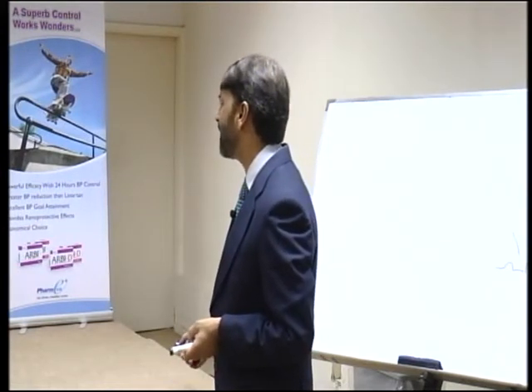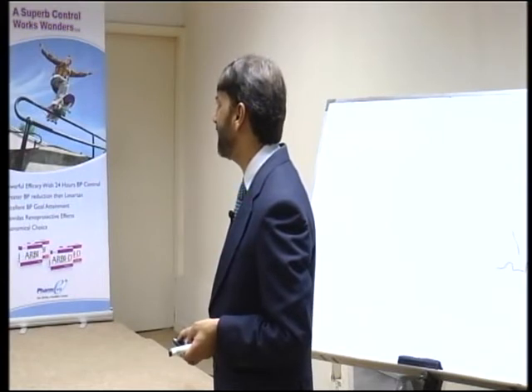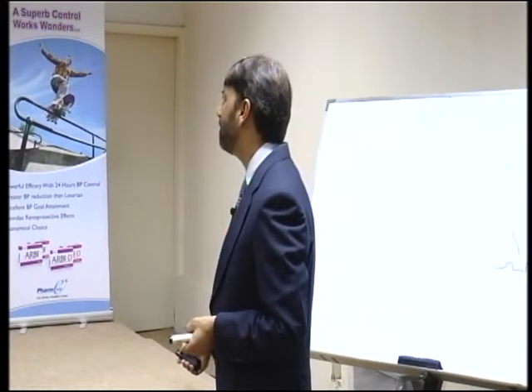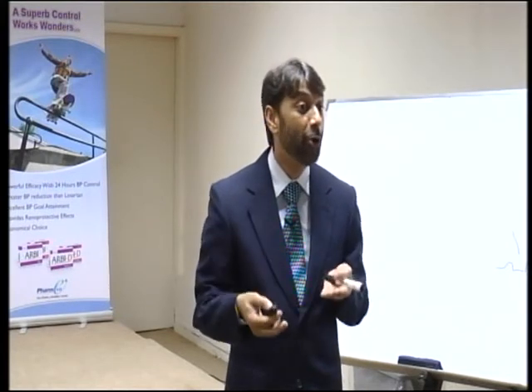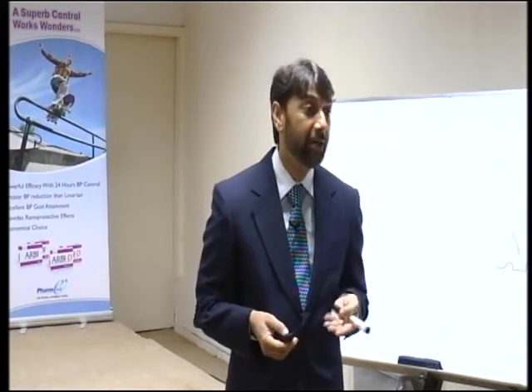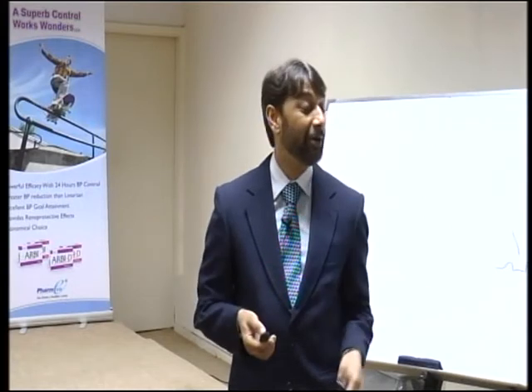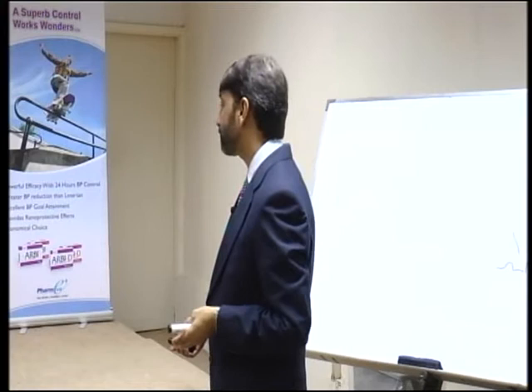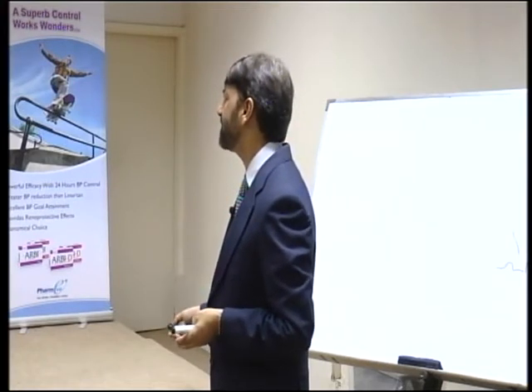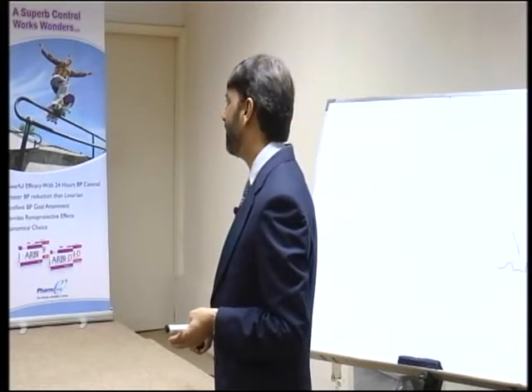Hyperacute T wave, I have already shown what it means. It may be hyperkalemia, it may be the initial evolution of acute transmural infarct. So what are we going to decide? Symptoms, background, whatever. Q waves, the first downward deflection, at least 2 millimeter deep and 1 small square wide.